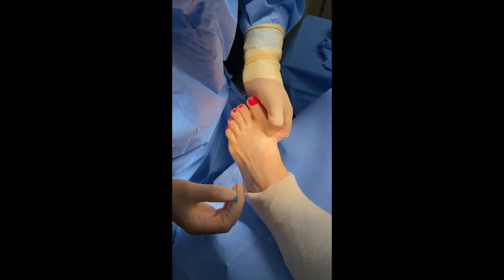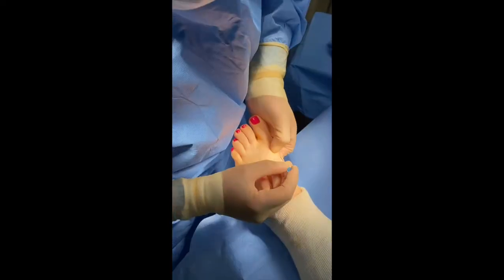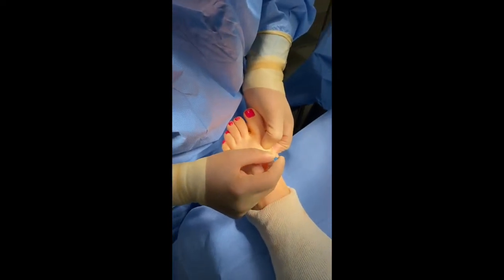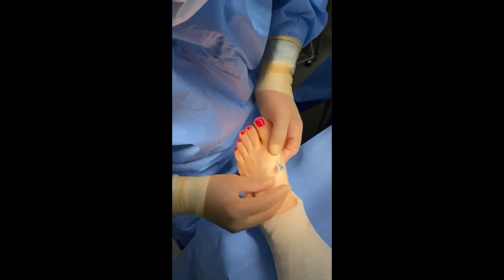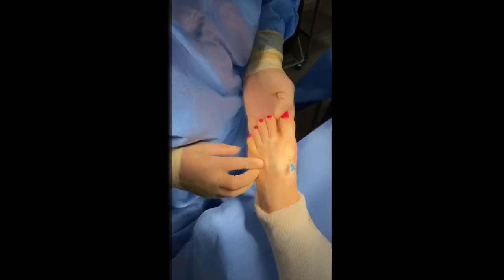What we're doing now is taking out a screw that we previously inserted for a bunion. With my thumb I palpate the head of the screw and stick a small needle down the center of the screw, because it's cannulated or hollow.